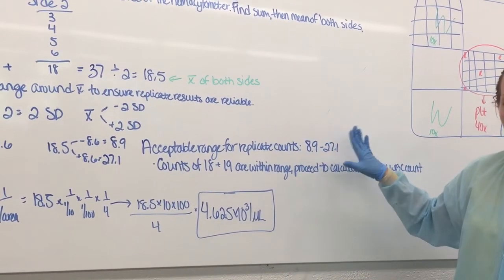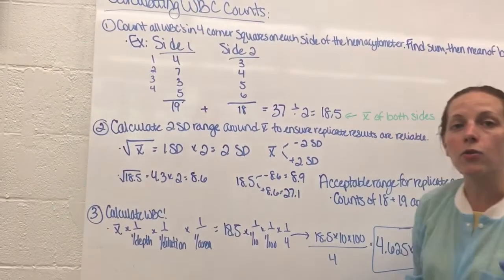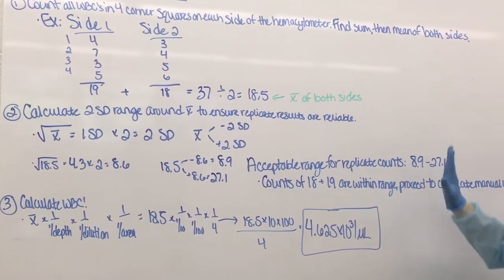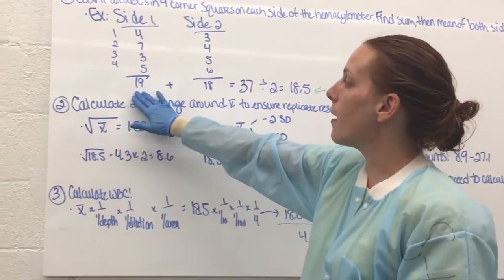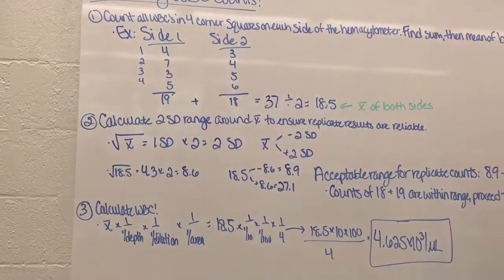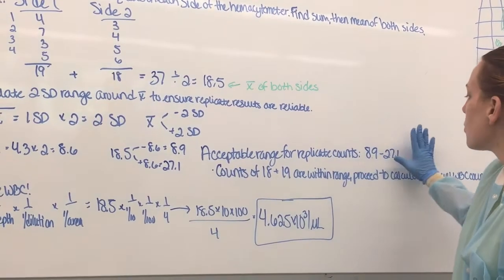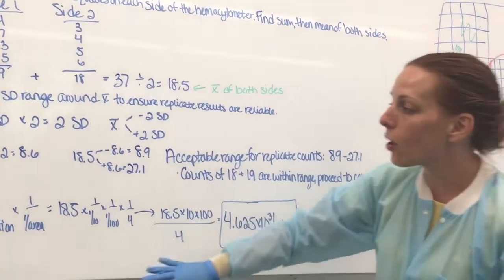Now, we're not done at this point because I need to go back up to what my side 1 and side 2 counts were and find out, were those within this range? If they're within that range, then I can say, okay, yes, I'm good. I know my numbers are going to be accurate. But if, for instance, side 1 had only been 7, let's say I had only counted 7 cells on side 1, 7 would be outside of this range, and so we would not be able to use these counts to calculate our WBC. So if both sides are within your replicate acceptable range, then you can go on and actually calculate your WBC.